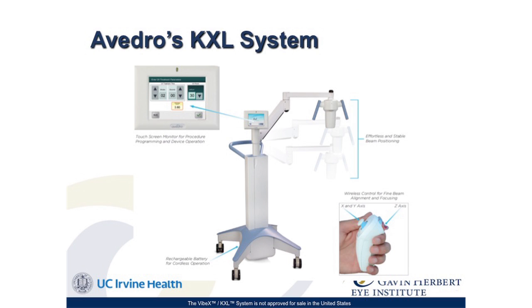Their cross-linking protocol or treatment is actually pretty mobile. The nice thing about cross-linking is it doesn't require an operating room. It can be done in the office. It is generally pretty easy for the patient to tolerate, but there are certain requirements that have to be met. This is just a schematic of their device. For people who play video games, this should look very familiar if you have a Nintendo at home. It actually is a Wii controller, and they bought an excess of these from wherever they were made and repurposed it to be used for their unit.